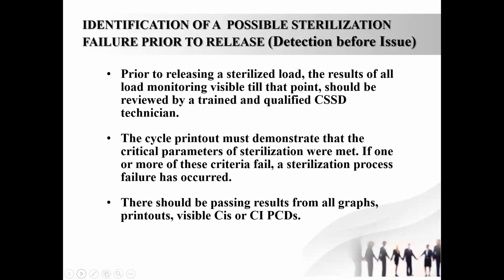So before the load is released, it is better to check the load. How do you check the load? The result of all load monitoring, which is visible up to that point. For example, external indicators, chemical indicators, whether the pack is intact. Also, all the gauges, graphs and printouts can be checked by a trained and qualified technician so that errors can be caught at this point itself.